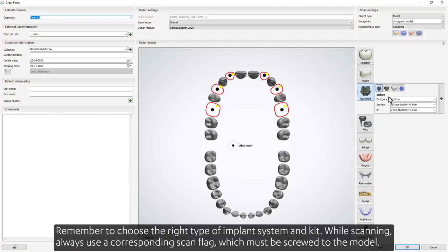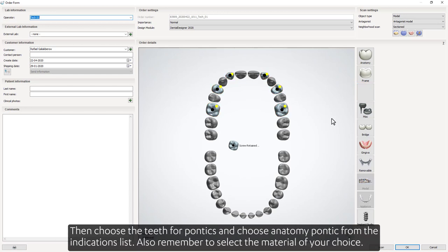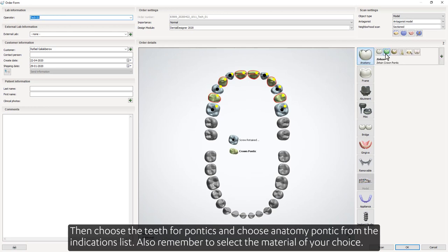Remember to choose the right type of implant system and kit. While scanning, always use a corresponding scan flag, which must be screwed in to the model. Then choose the teeth for pontics and choose Anatomy Pontic from the indications list.